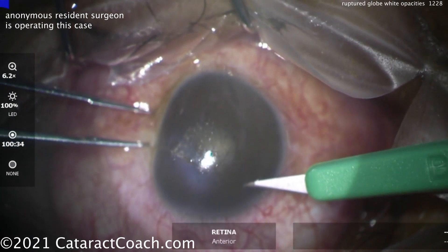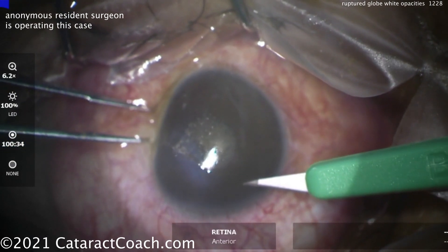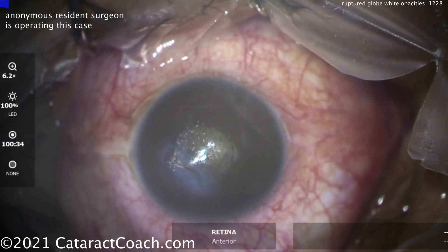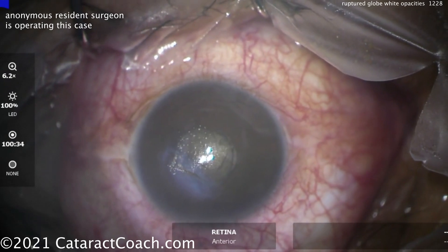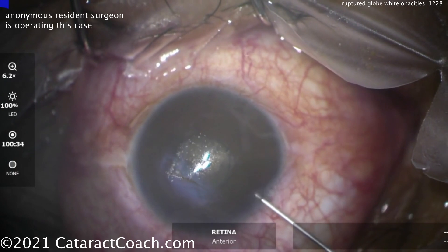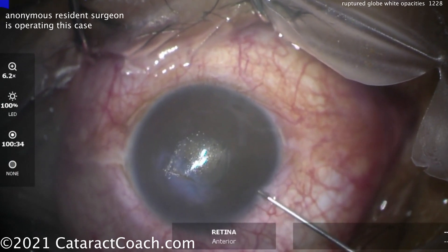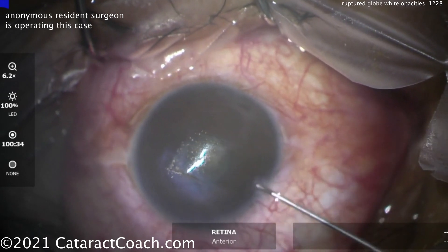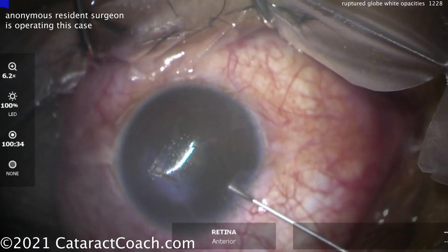So this obviously needs to be fixed. The resident is doing the case. There's the initial laceration. A paracentesis is being made — it's a good idea to start off with a paracentesis so you have access. You want to put some viscoelastic in the eye, but don't overfill it — put in enough viscoelastic that you can form the anterior chamber.